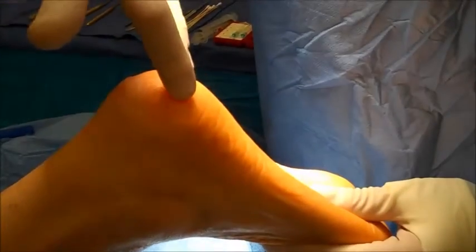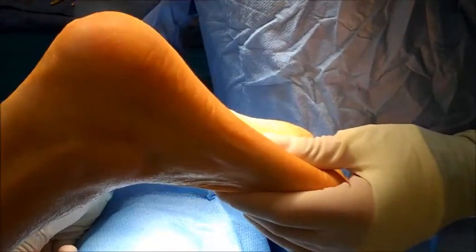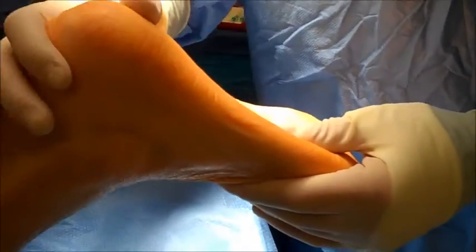The goal of the procedure is actually to cut the middle portion of that band that extends from the heel all the way to the toes to release that tightness. We're going to be doing that with an endoscope — it's called an endoscopic plantar fasciotomy.